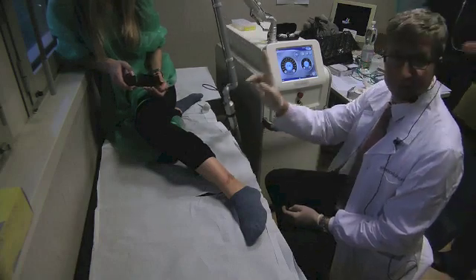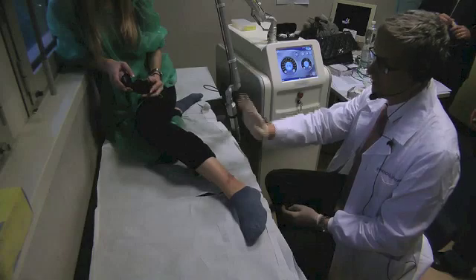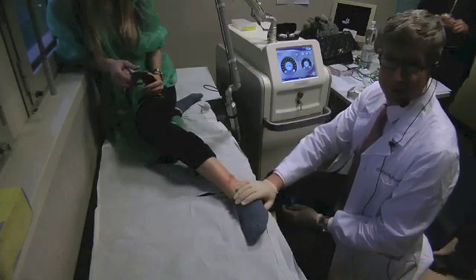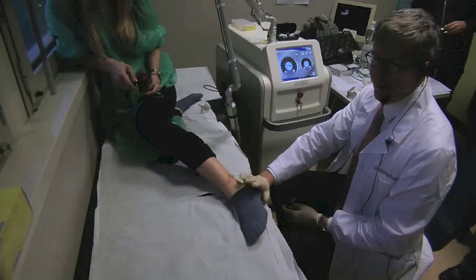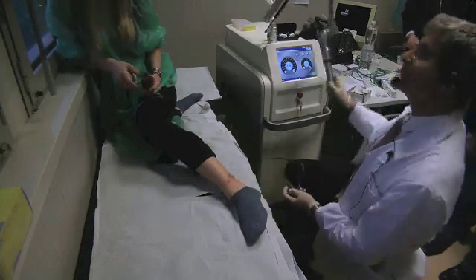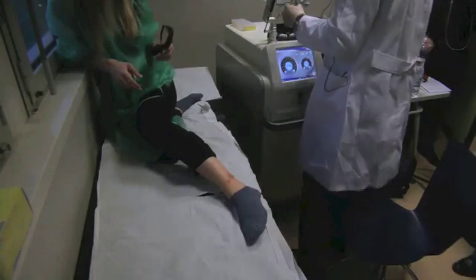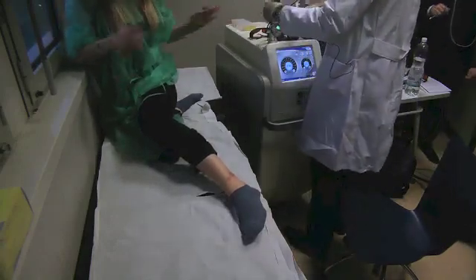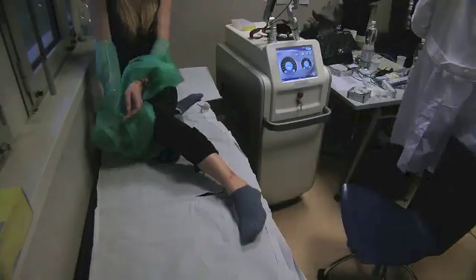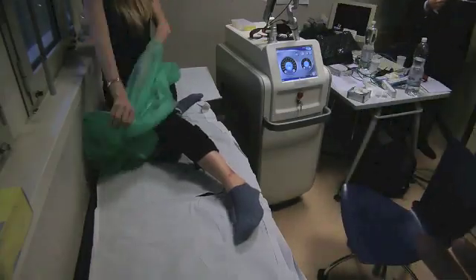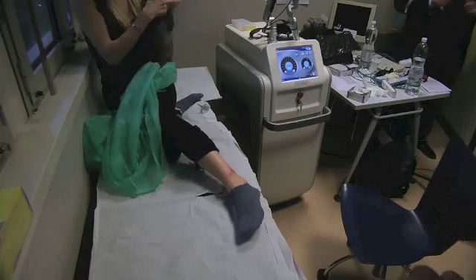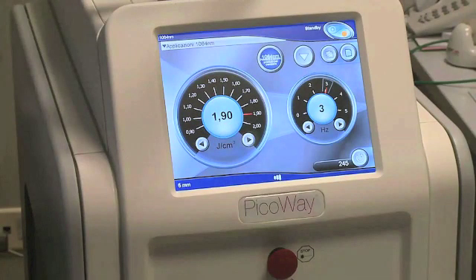Did she consent to showing her face? No, she did not. Otherwise you would see a perfectly smiling young lady. Thank you very much for contributing. We will change patient. The question from the audience is: how many days of cortisone therapy do I use? Usually I use it for three days — immediately after treatment, then the day after, and the next day.